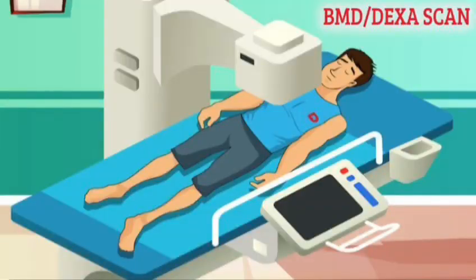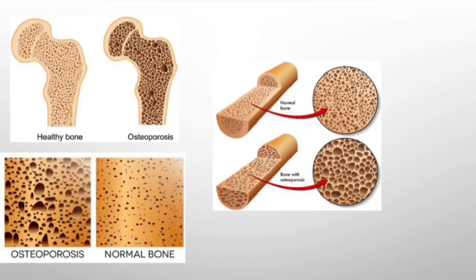Hello everyone. So today's topic of discussion is DEXA, which stands for Dual-Energy X-ray Absorptiometry. It is the gold standard investigation of osteoporosis. Osteoporosis means osteo as bones and porosis as pores.